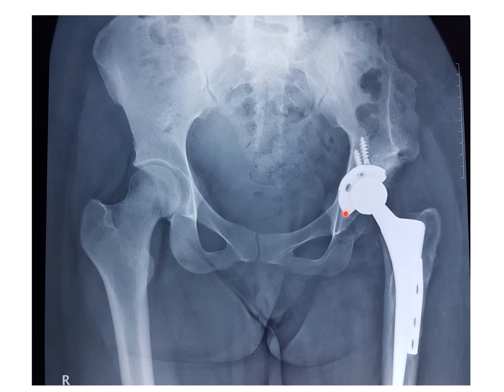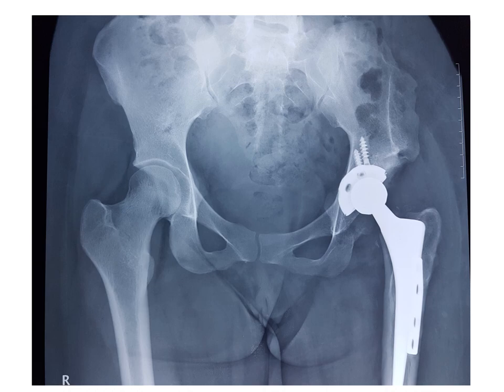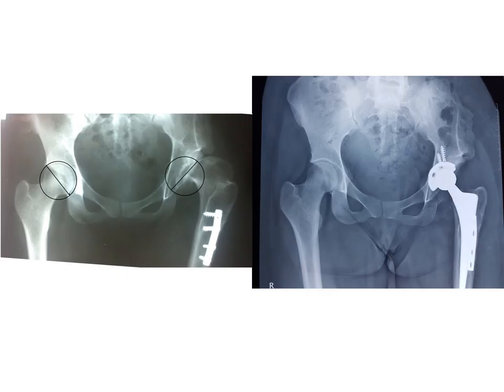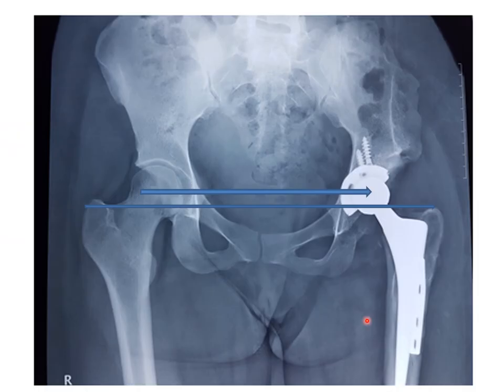We stabilized the cup with a couple of screws. With the femur brought down to normal height, we inserted the stem safely, ensuring it would not touch the buried plate while inserting the rasps. The pre-operative plan was successfully executed: the center of the hip is almost the same height as the normal side, and the two greater trochanters are almost at the same height.